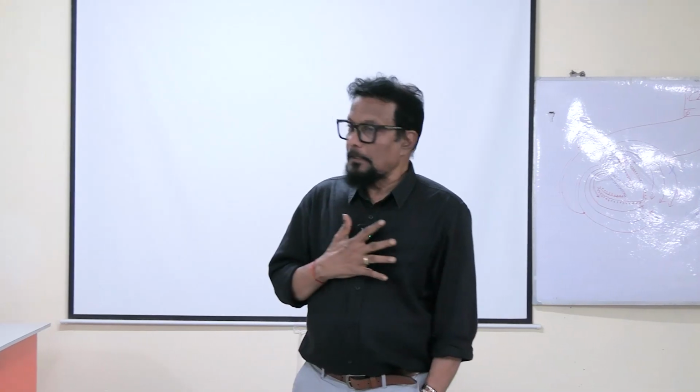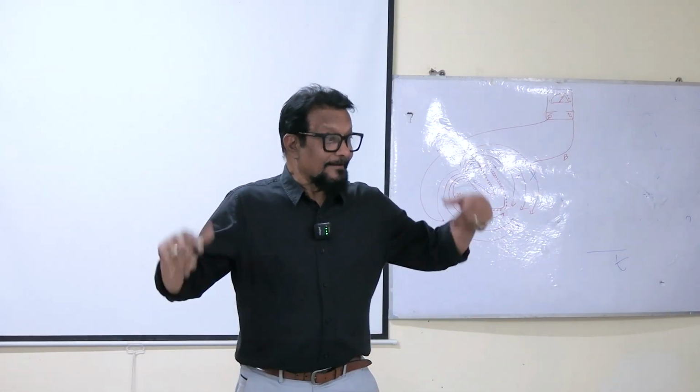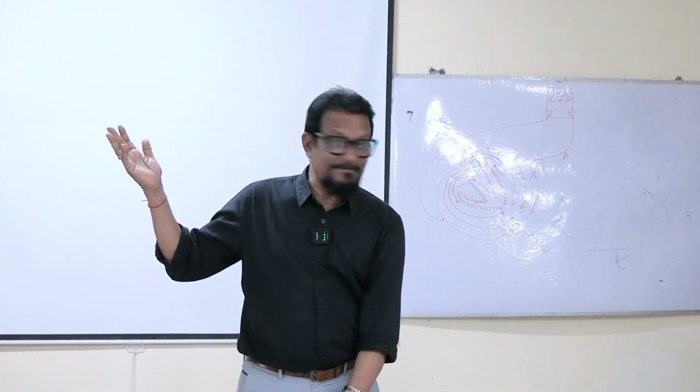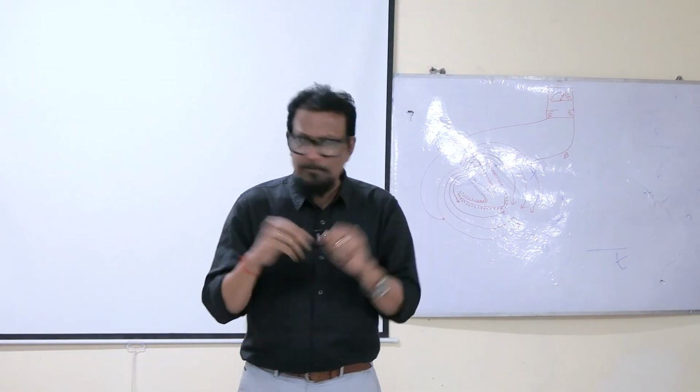One more thing. Think of a triangle. What type of triangle? Equilateral triangle. Very good, I think you are studying ECG. Connecting two limbs is one side, this limb and this one is another side, and this limb to this limb is another side. I'll make it easier.